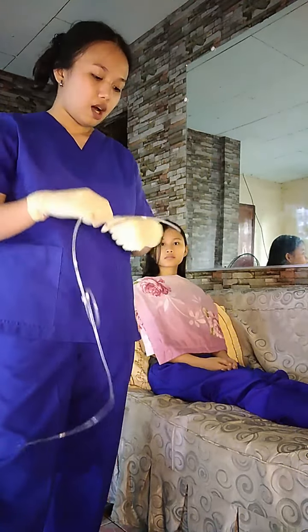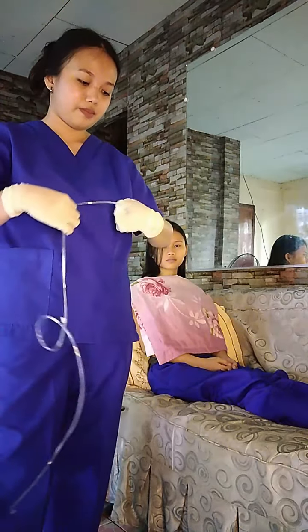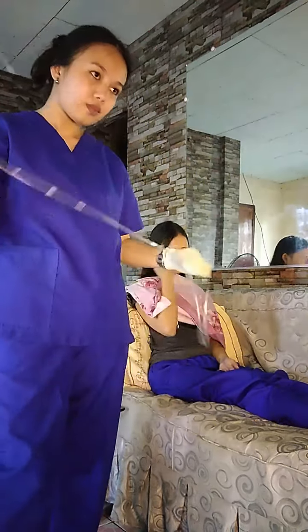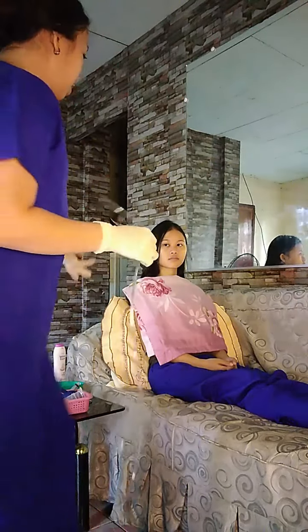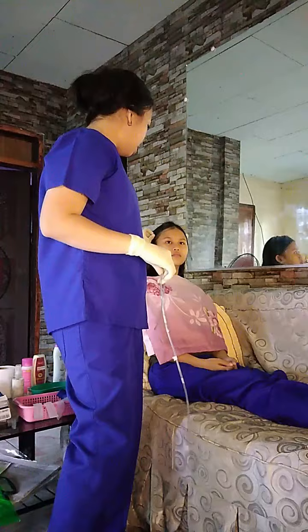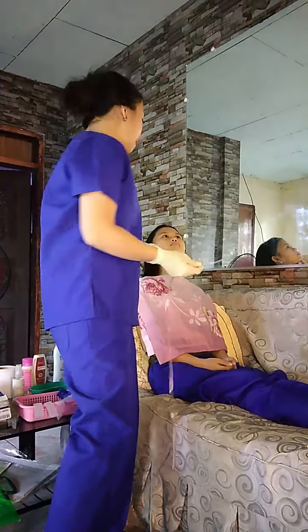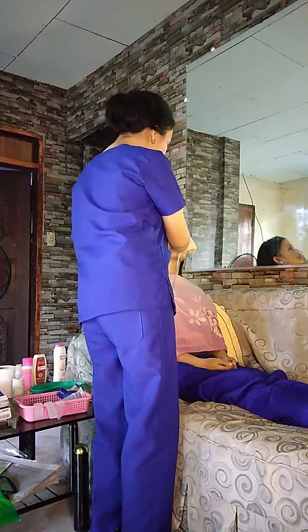Making sure that everything is covered by the water-soluble lubricant. So now that I have lubricated it, I will now insert the tube on the right nostril of the patient. So first, I will tilt the head upwards and then insert it until it reaches the nasopharynx.